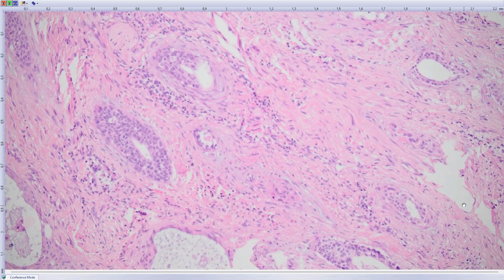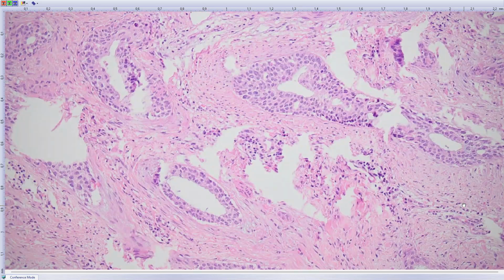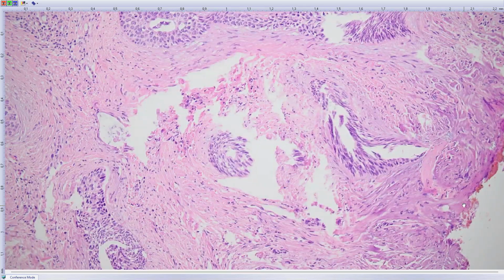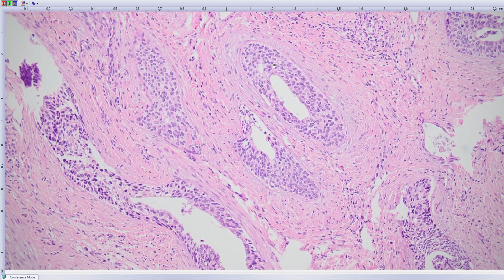And when you see a tumor that has carcinomatous squamous cell appearance, like here, or basaloid, and adenomatous admixture to that, you can be 100% sure that it is high-risk HPV. Now you can see here adenomatous differentiation. You can see it here even with brush border. You can be perfectly sure that the lesion is a high-risk HPV-induced lesion.